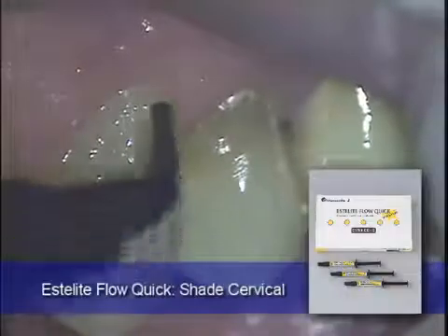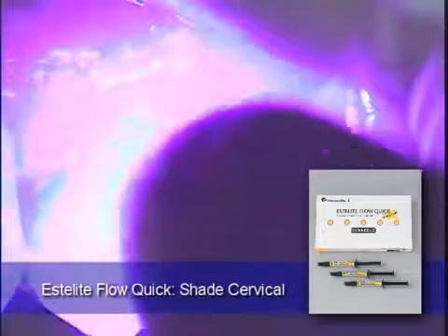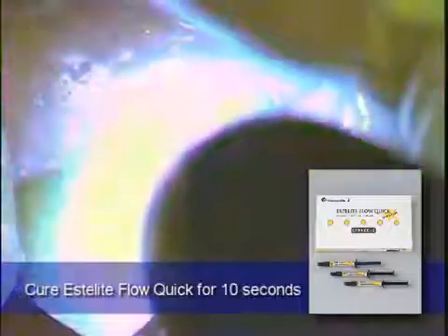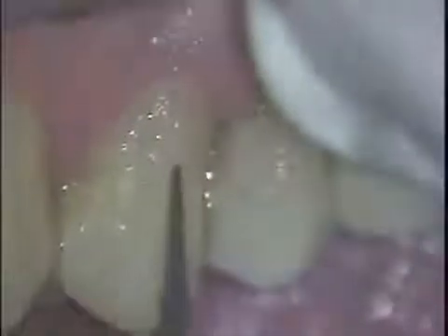Using the applicator tip, the material can be sculpted into place to allow for easier finishing upon completion of filling the tooth. The two premolars are completely filled now using the Estelite Flow Quick in the cervical shade, and are finished using fluted carbide burrs, as well as silicone points and cups.